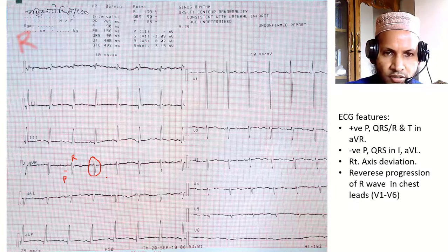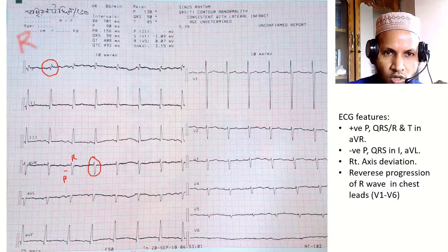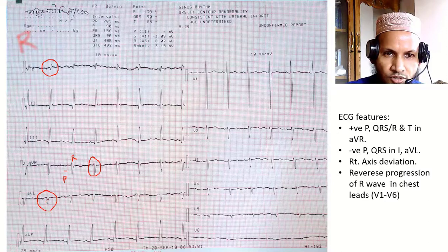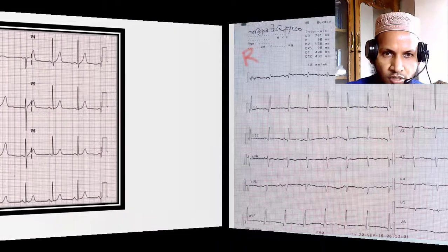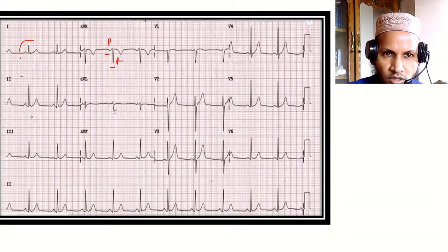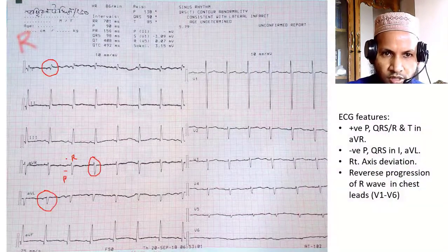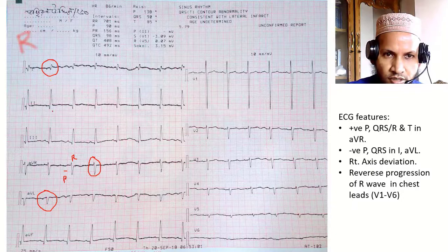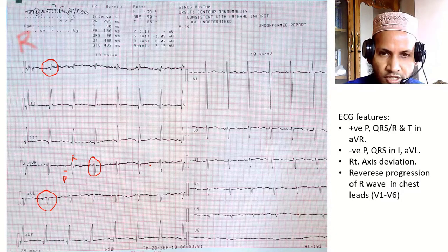To differentiate true dextrocardia from technical dextrocardia, we should look at other features. In lead I and AVL, the P and R waves are negative — this is abnormal. In a normal ECG, lead I and AVL show positive P and R waves. In this ECG they are abnormal in leads I and AVL.